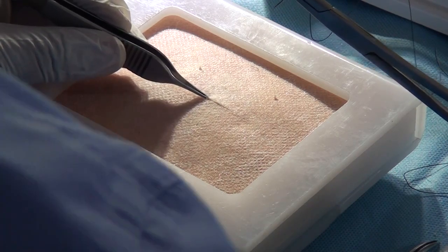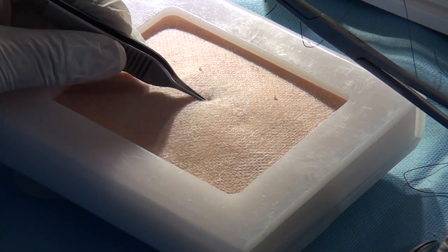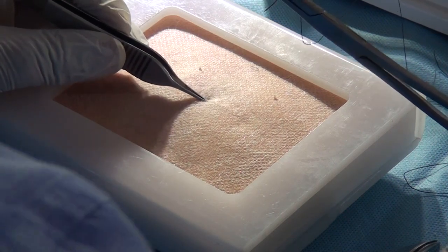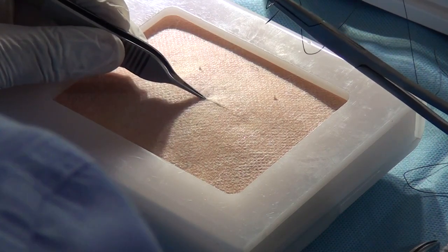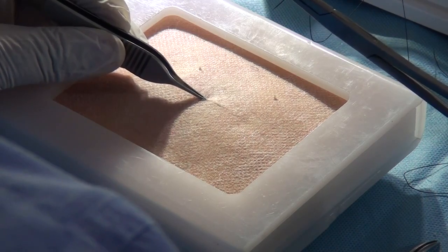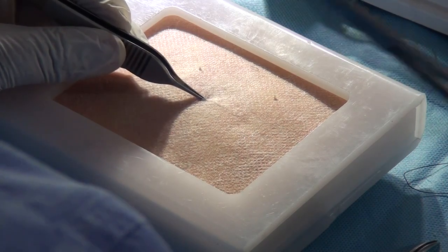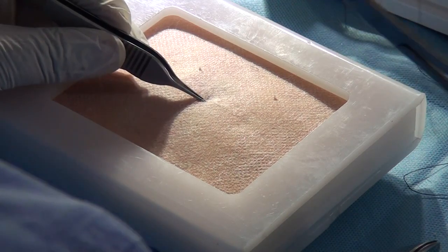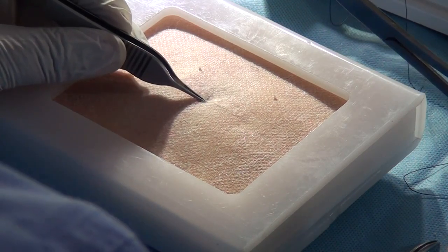But that's in adults. In children, it will not be 1 centimeter. So the rule of twice the depth of the wound is more likely to apply everywhere. If the depth of the wound is X, your bite is 2X, the distance between the two bites is 2X again, and the length of the suture is 2X.